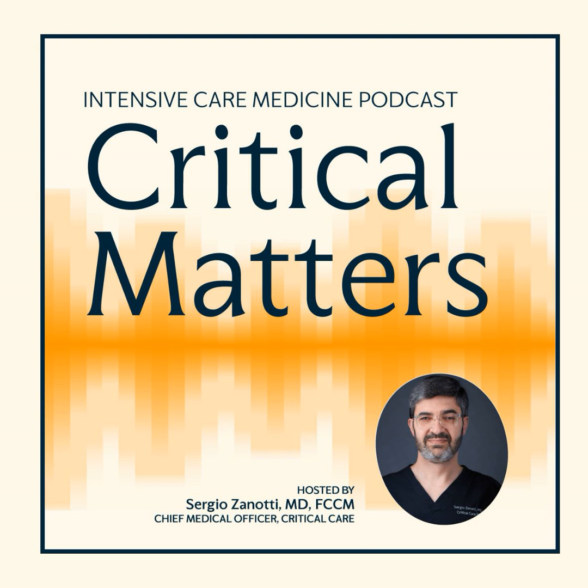Excellent. So I think what I'm hearing is that when you do procedures, you're only going to do the procedures that are absolutely essential. You're going to minimize the interruption with CPR, and I presume that if you're doing an arterial line, you're doing it probably radially while people are doing CPR. Is that correct? No, actually, I do all my lines femorally during a code. And I do that because I'm out of everyone's way.